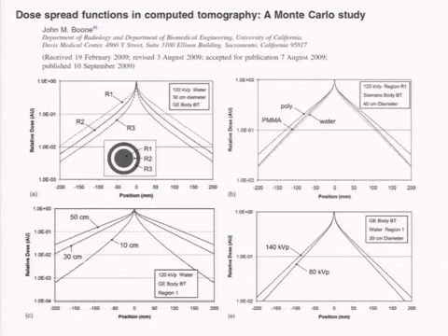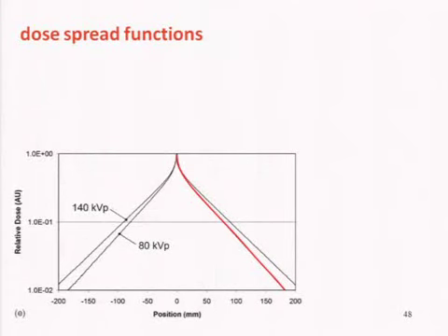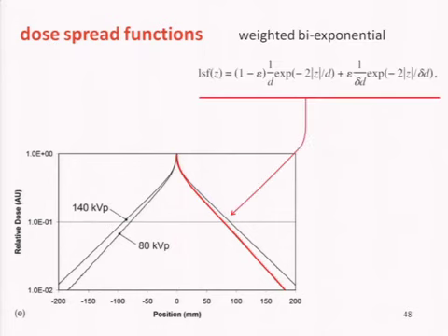And we looked at this trend as a function of position in the phantom, composition, diameter of the phantom, and the energy, the kV of the X-ray beam. A couple of things become apparent. On the semi-log plot you can see the linear tails, and so indeed this is a curve that can be well characterized by a biexponential curve, as you see listed here.